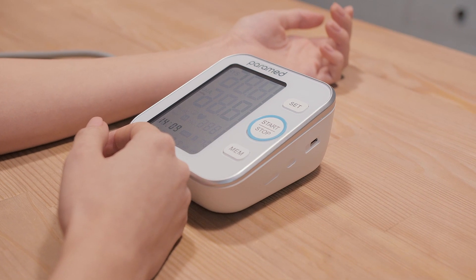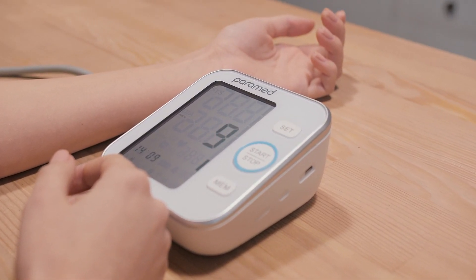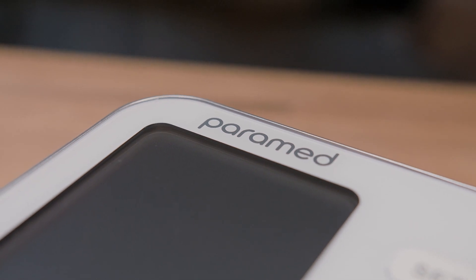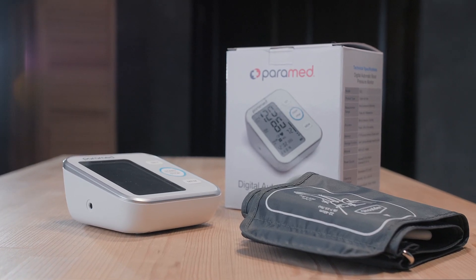6. Do not measure blood pressure several times in a row without removing the cuff. Wait at least 5 minutes between intervals. An automated blood pressure monitor from Pyramid is designed to make your healthcare as easy and comfortable as possible. Watch your health and be healthy.